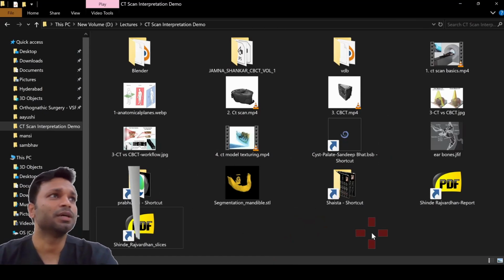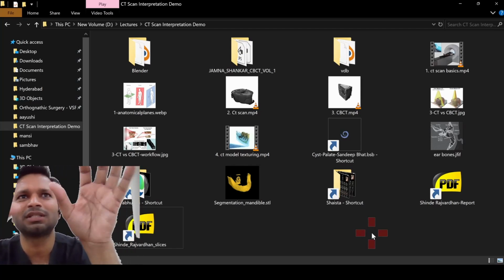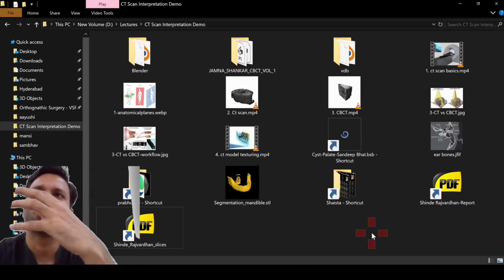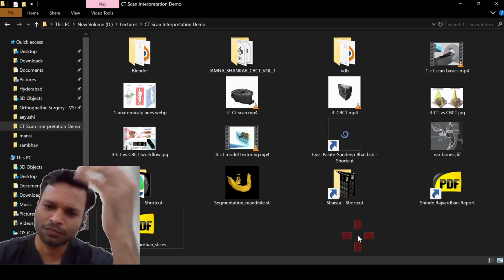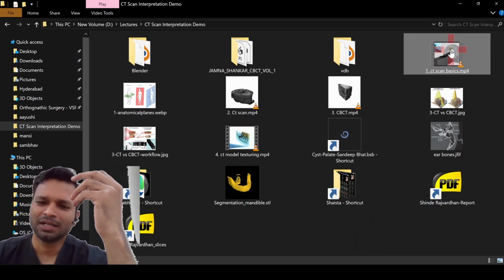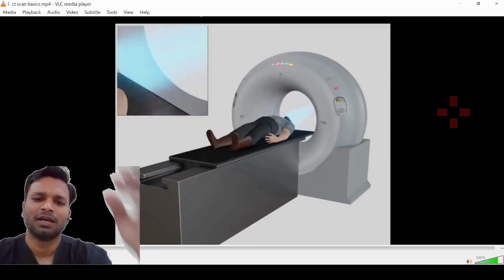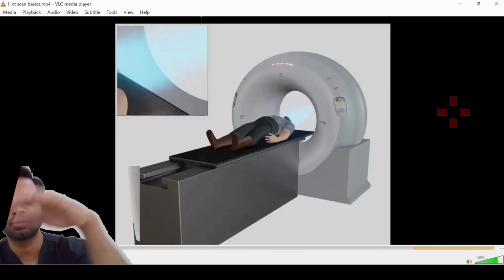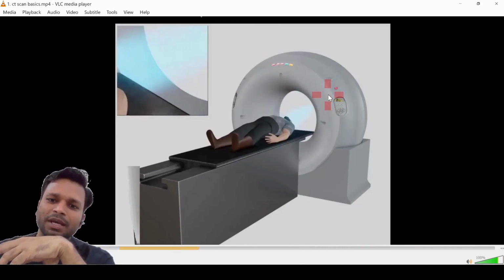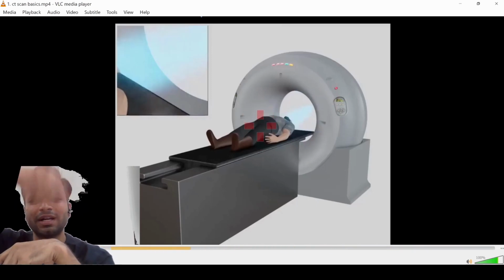Okay. So first of all, what is a CT scan? Basically, currently we have two technologies, conventional CT scan and then we have CBCT that we do it here, cone beam CT scan. Okay. So first we are going to talk about conventional CT scan. So basically, ये तो देखी होगी machine. This is a CT scan machine, right? The patient is passed through this huge ring. ये ring में donut shape ring. इसमें एक side पे we have the X-ray emitter, दूसरी side पे we have the sensor, and it is rotating at a very high speed.